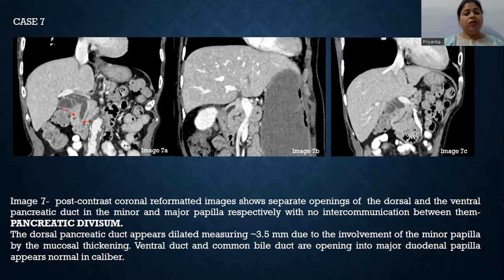Case number seven demonstrates pancreatic divisum. Post-contrast coronal reformatted images show separate openings of the dorsal and ventral pancreatic ducts into the minor and major papilla respectively, with no intercommunication between them. The dorsal pancreatic duct appears dilated due to involvement of the minor papilla. The ventral pancreatic duct and common bile duct open into the major duodenal papilla, which appears normal in caliber.